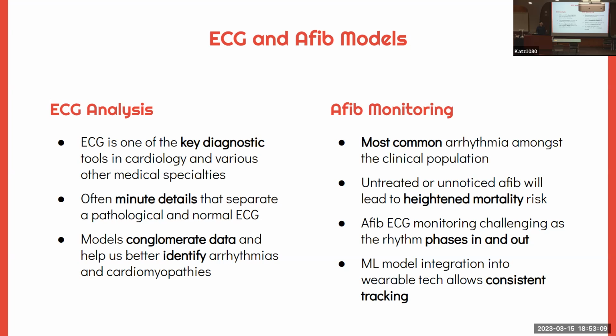And the issue is it's often really minute details that separate a pathological and a normal ECG. And what ML models are really good at doing is picking up on those minute details much better than a clinician can, especially when that clinician is in an acute situation under a lot of stress and doesn't necessarily have the time to whip out their trusty ruler and be like, aha, this wave is slightly too high.